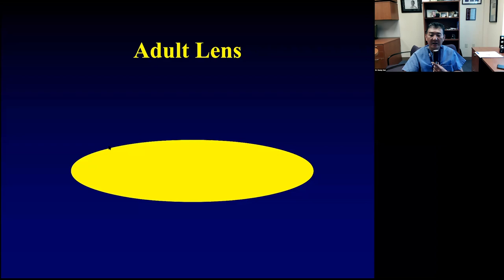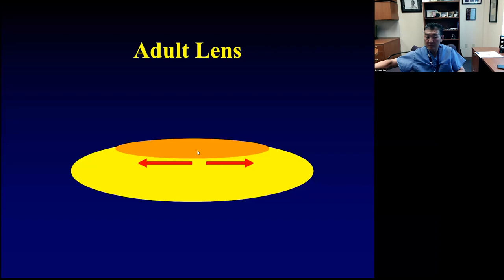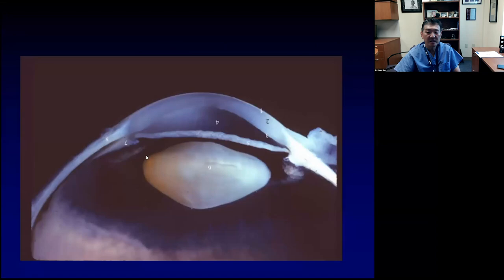So when you're trying to perform the tear in one direction, there's a counterforce that's going in the opposite direction. When you're trying to tear paper, you actually need counter traction and traction. For example, like this. That counter traction has to go completely opposite, 180 degrees in the opposite direction, for you to make the tear. However, in pediatric patients, the anterior surface is pretty convex.